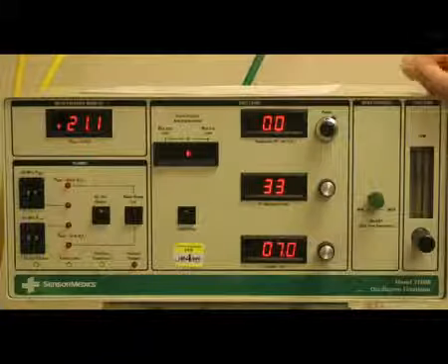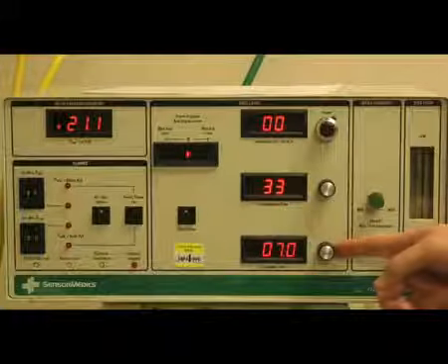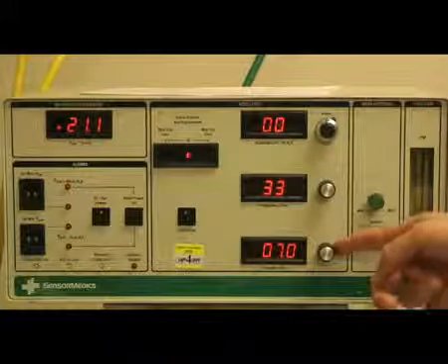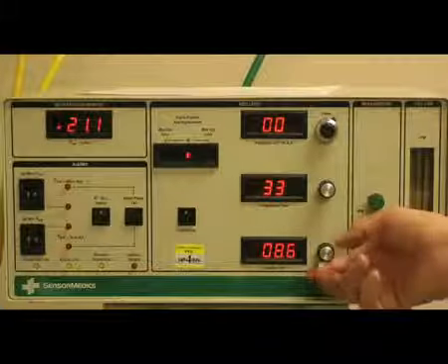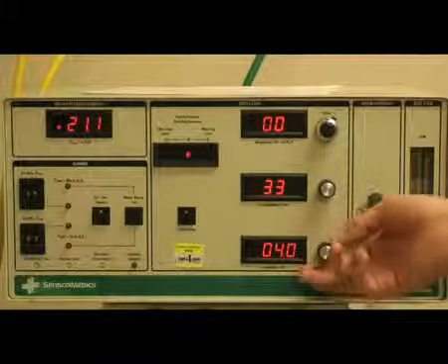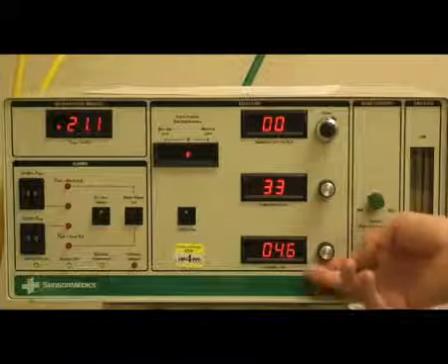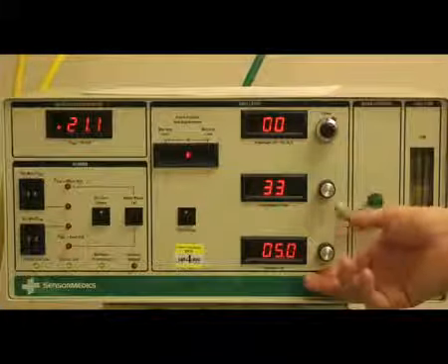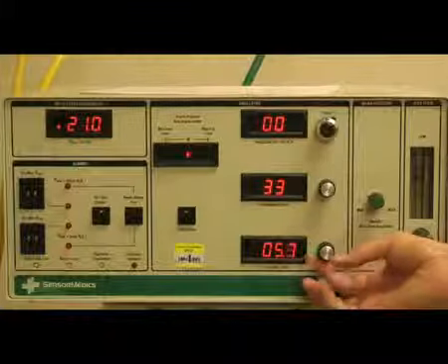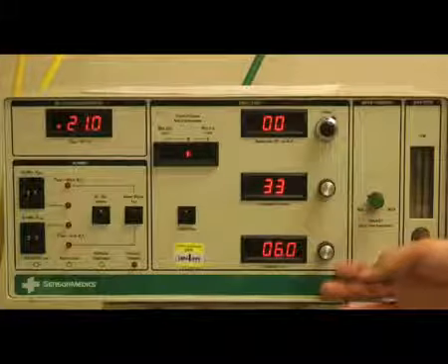Once you have set your amplitude, you'll want to adjust your initial frequency based on recent arterial blood gases. For this, you'll want to look at the patient's pH. If their pH is less than 7.10, you'll want to start at a Hertz of 4. For a pH of 7.10 to 7.19, you'll want to start at a Hertz of 5. For a pH of 7.20 to 7.35, you'll want to start at a Hertz of 6. And for a pH of greater than 7.35 on an initial blood gas, you'll want to start at a Hertz of 7.